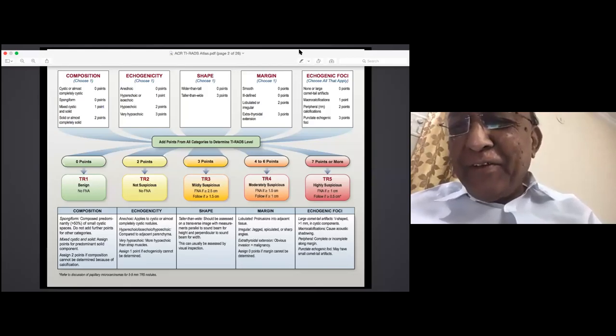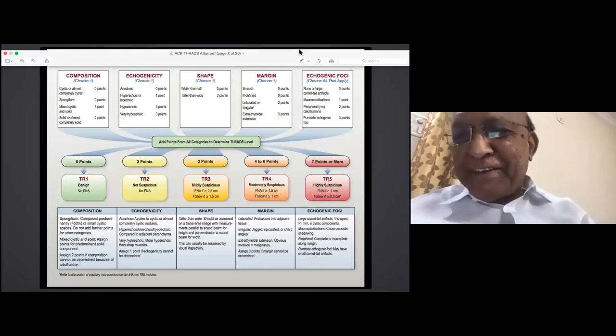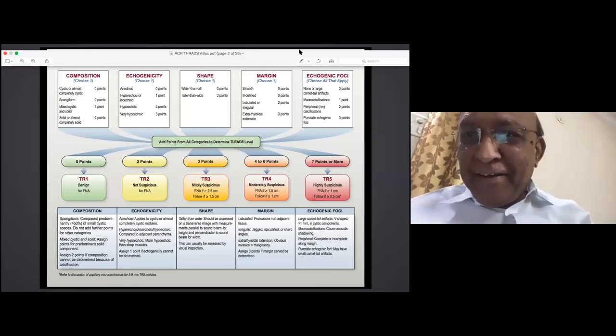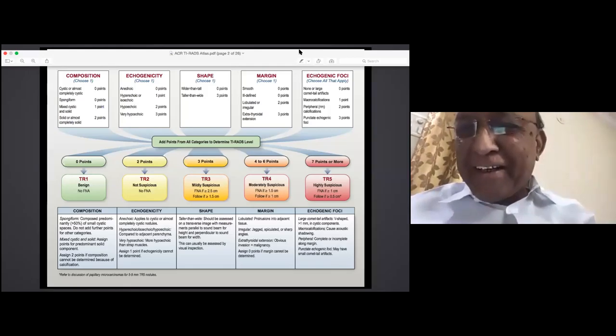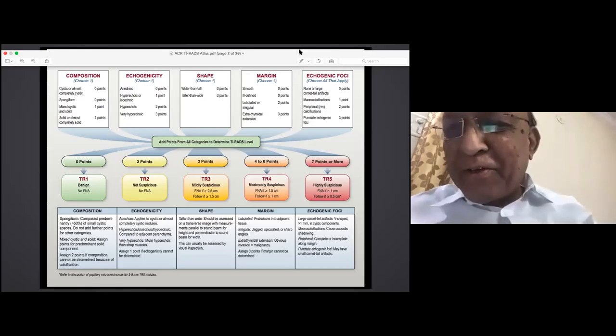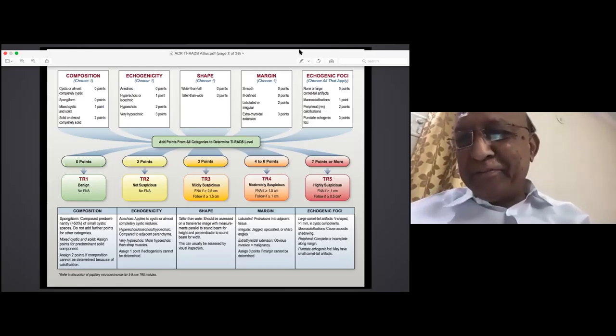At least we can now see the ultrasound reports and make the difference between a cyst and malignancy. Usually, as non-ultrasound specialists, we see only the report. Now we learn to see the complete ultrasound report. Thank you, sir.